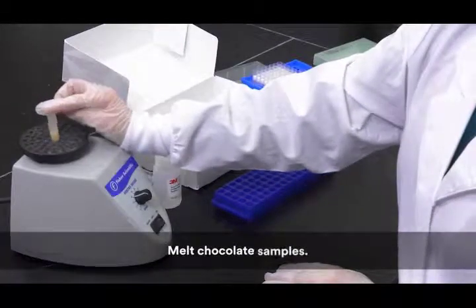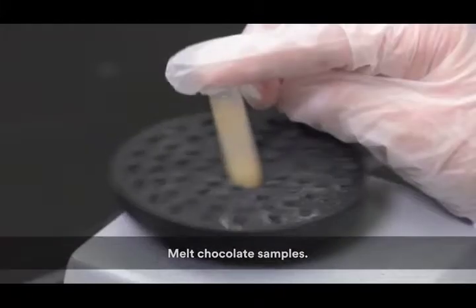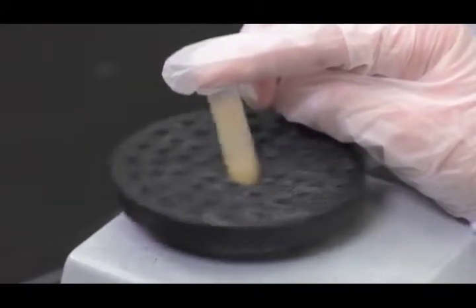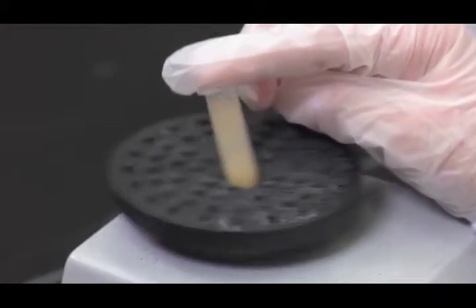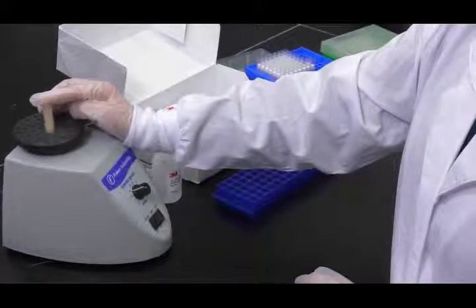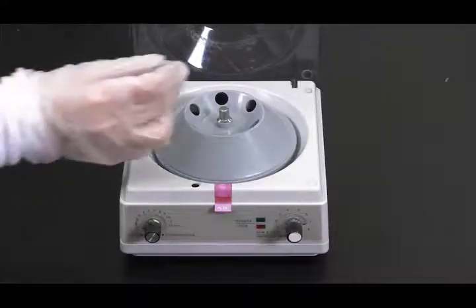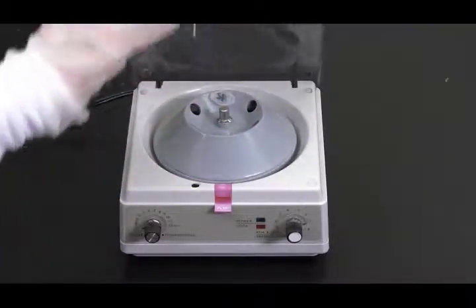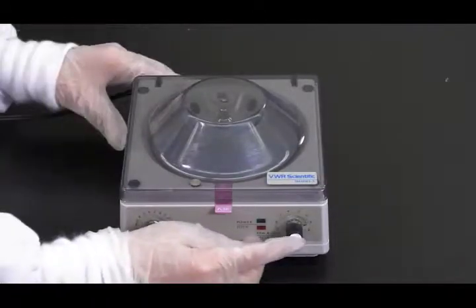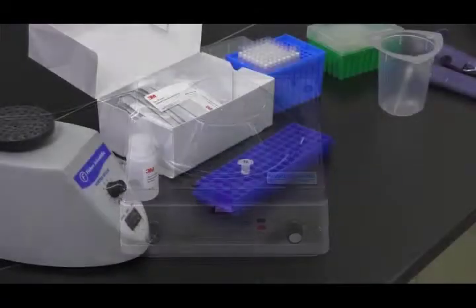Then add 1.8 milliliters of the 3M extraction buffer to the sample in the microcentrifuge tube. Shake vigorously or vortex for 15 seconds to mix thoroughly. Next, centrifuge the tube for 20 to 30 seconds at 5,000 to 7,000 rotations per minute. The supernatant is the extracted sample.